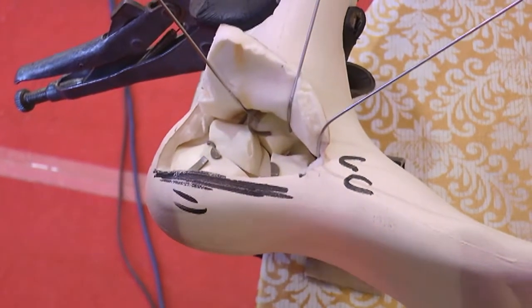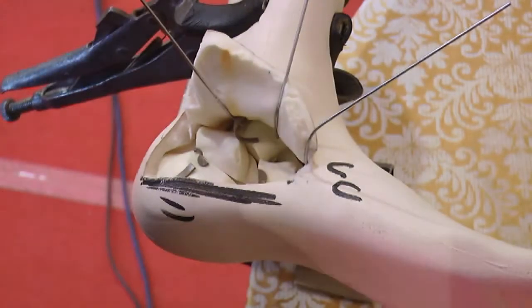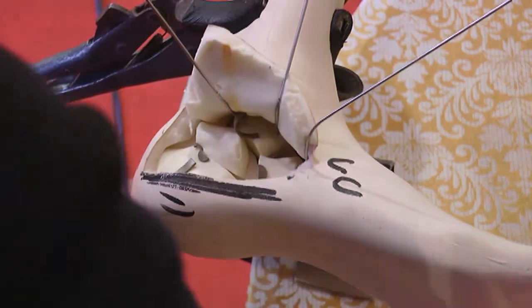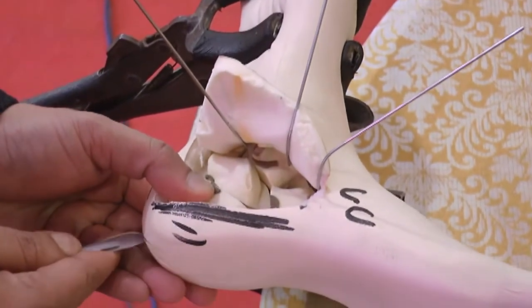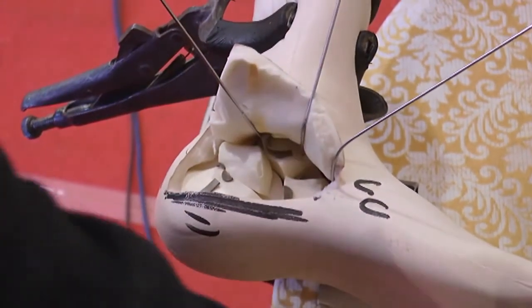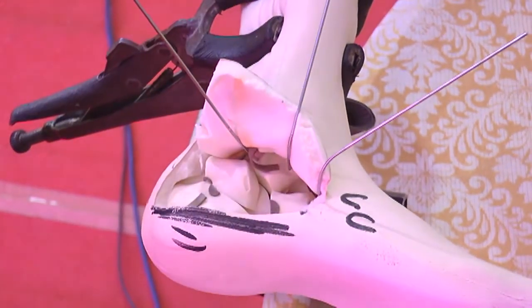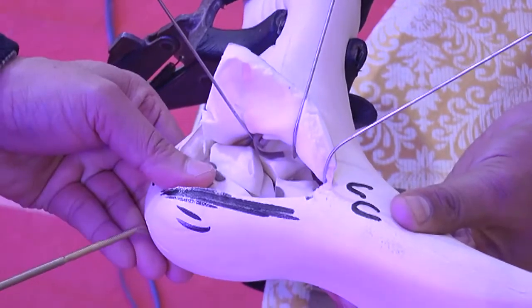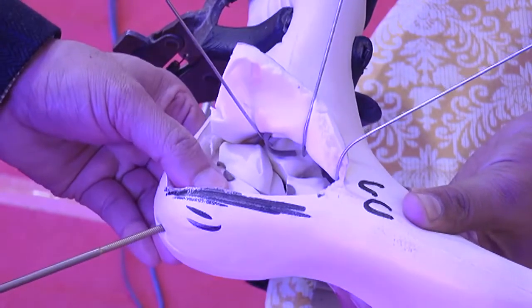Now you have visualized the fracture. The next step is to first align the tuberosity. So we will take a Schanz pin on a drill. Here in this situation, you can do it with a stout Steinmann pin, but most of the times what I have found is that if you use a Steinmann pin, the moment you try to manipulate it, it becomes loose and you don't have a purchase in the bone. So I have now started to use a 3.5 millimeter Schanz pin, and I don't use a drill bit, I directly drill it.